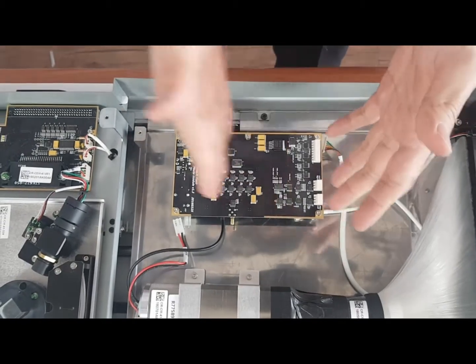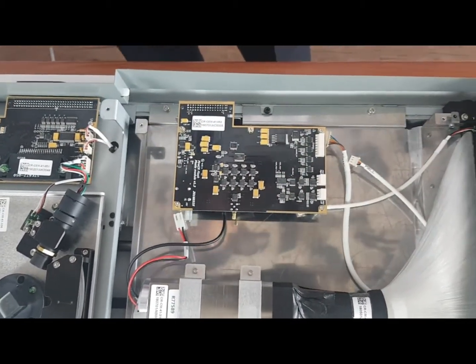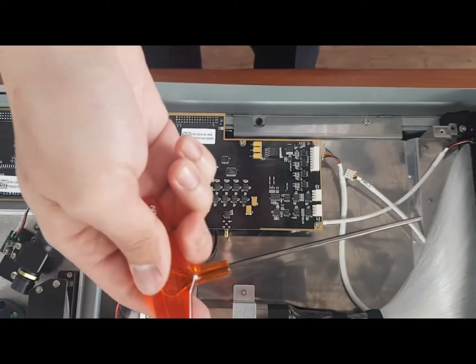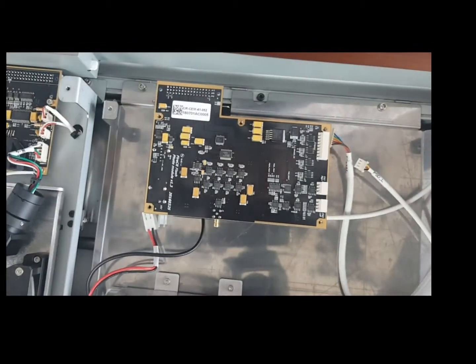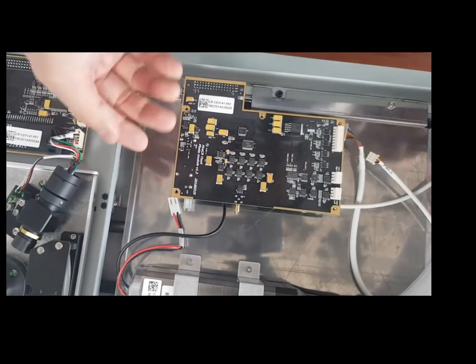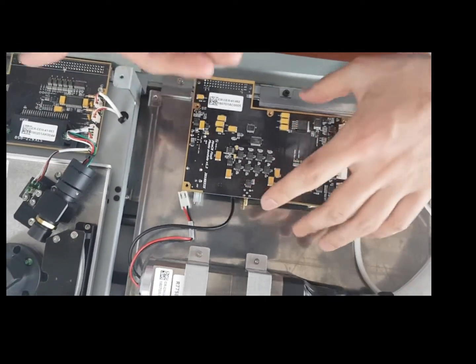Now it's time to remove the screws using a 2.5 hex key. I have just removed all the screws — just take the photo module out now.